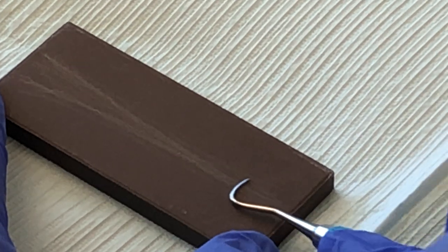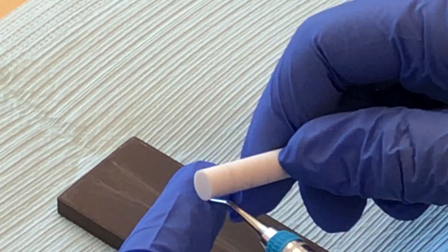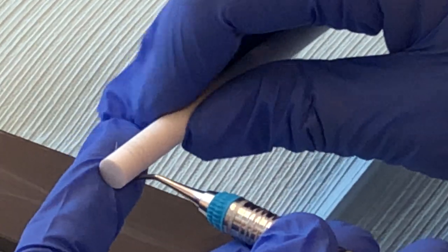If you don't let them go too long, two or three swipes will do it. Use your round stone. Knock off any wire edges.